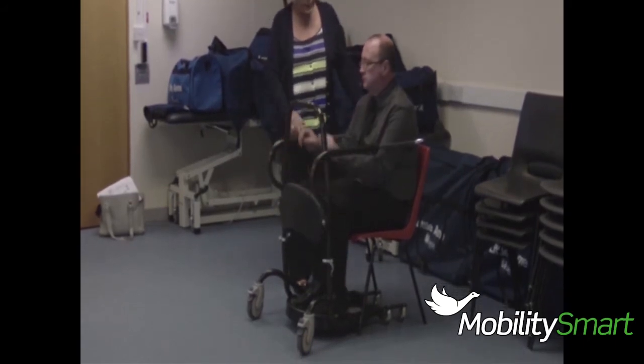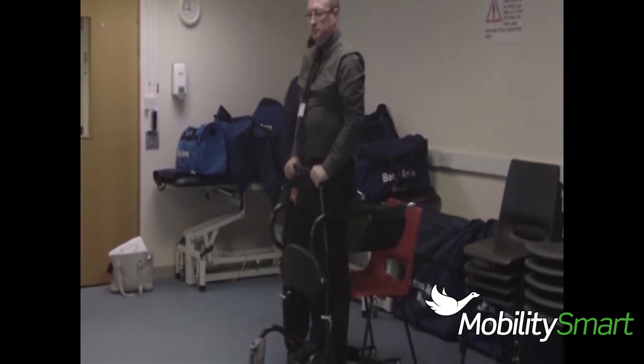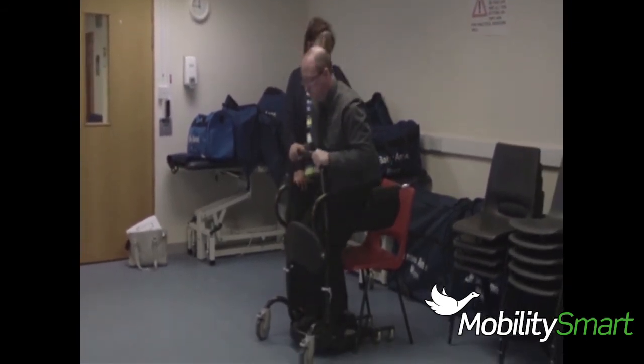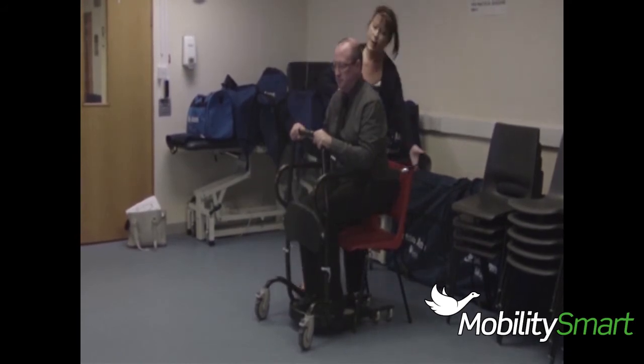So when you're ready, however you like, you can stand up for me, and then I'll bend the knees and sit straight back down. Good. I'm now going to close the back. It's that simple.